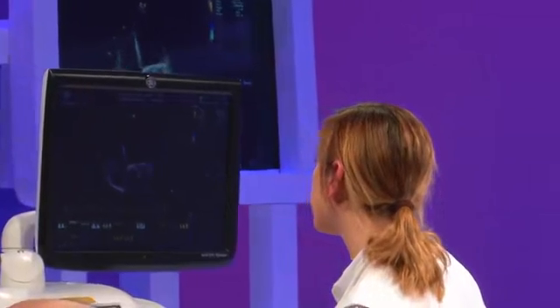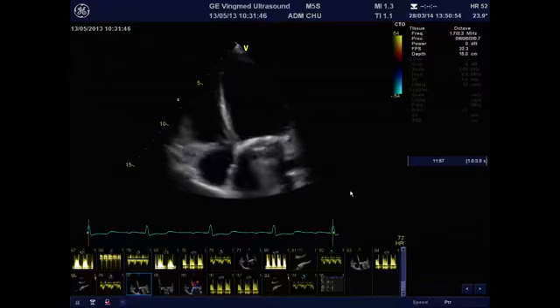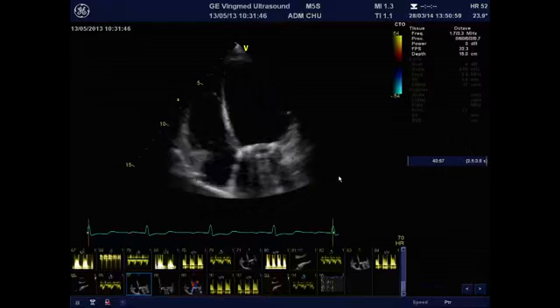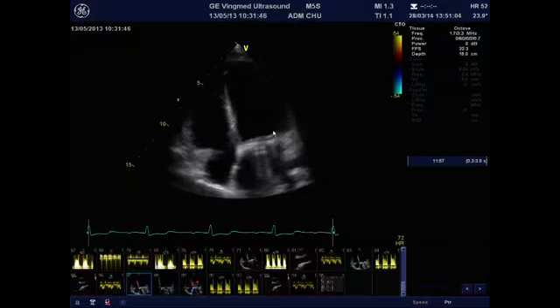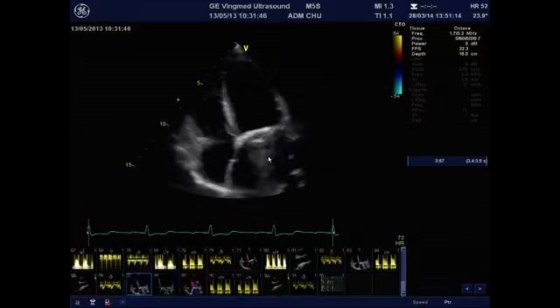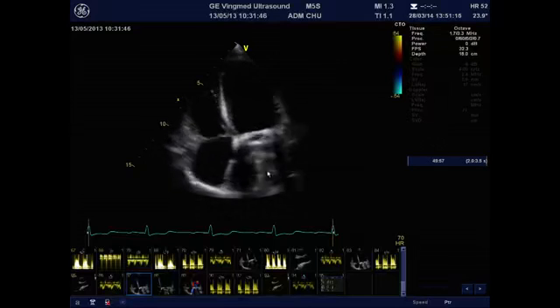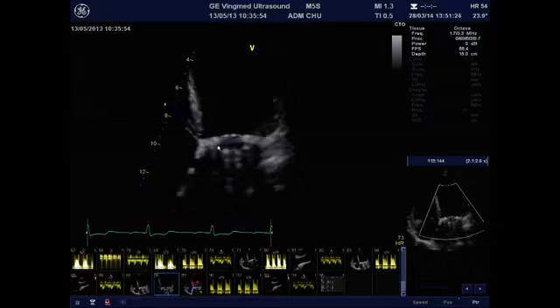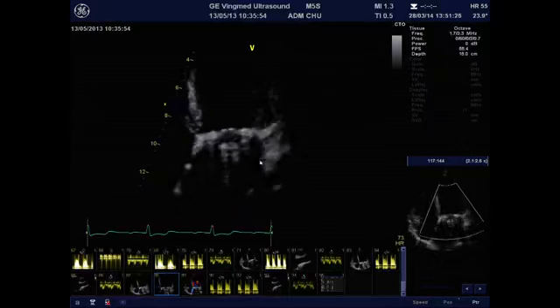Here, this is a young patient of 16 years old. She received a mechanical prosthesis in the mitral position when she was 8 years old. So this is a really small prosthesis. It's a Carbomedics number 23. And the patient presents progressive dyspnea since 1 year. Here you can see when you assess the mobility of the disc, the mobility is strictly normal. And if you use the zoom mode, you can see that when you look at that prosthesis, it seems to be completely normal.